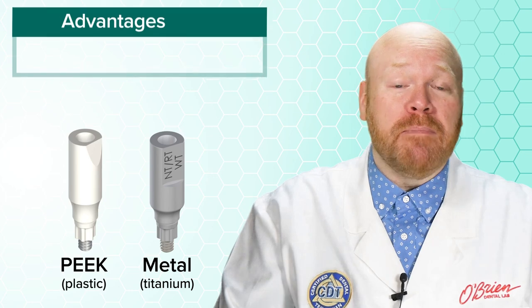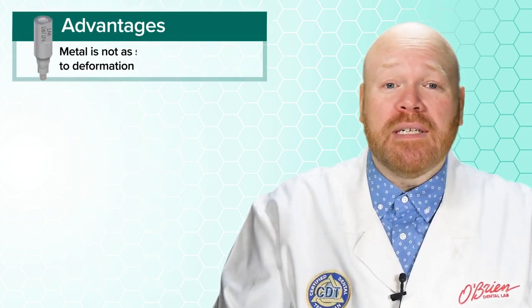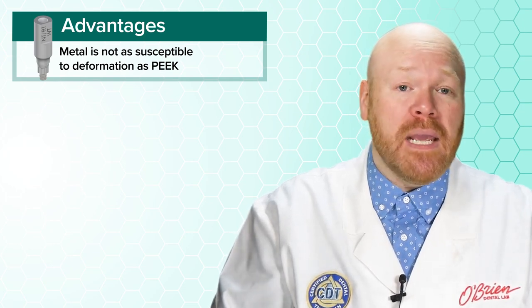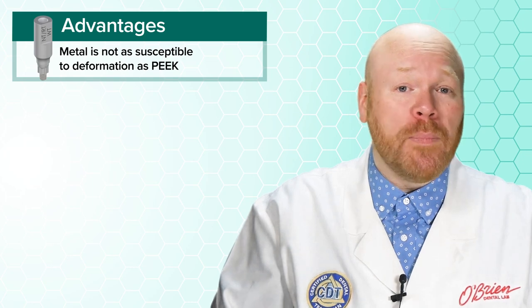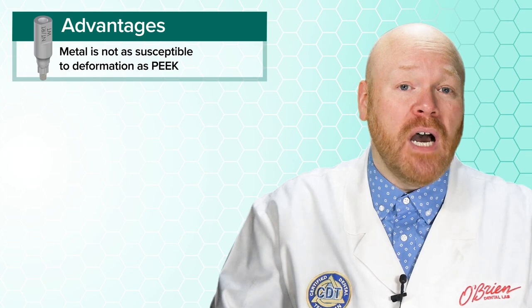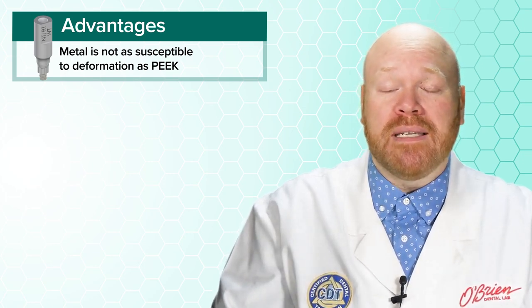There are some major advantages of titanium versus PEEK. First, titanium isn't nearly as susceptible to deformation as PEEK. PEEK scan bodies will typically warp with repeated use, but worse than that, they can even be deformed on first use if proper care isn't taken to ensure that they're being seated correctly.